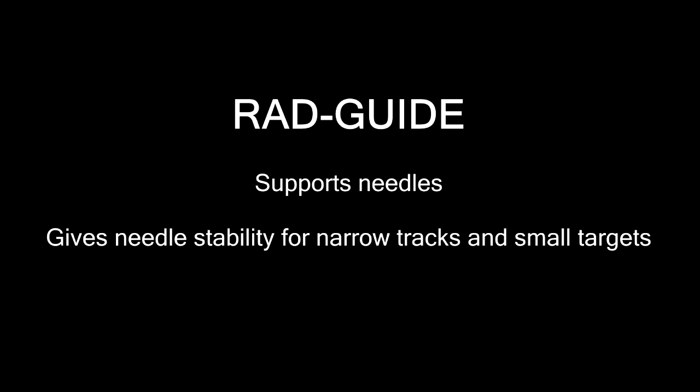In this clinical case, the RAD-GUIDE shows its usefulness in supporting the needles, especially when there is very little tissue support, which is often seen within the chest, and it gives needle stability, especially useful for narrow tracts, and also seen with small targets.